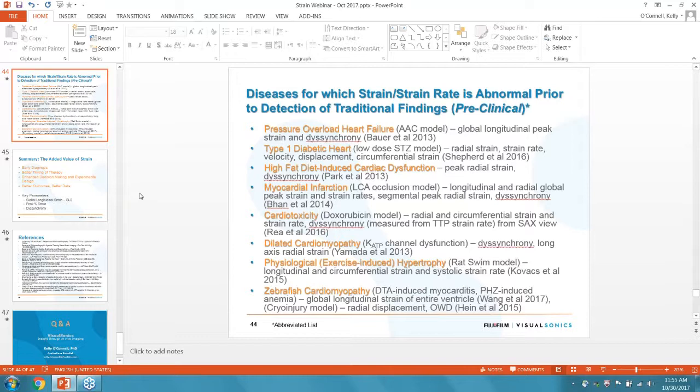validating strain values has all been based on the contractile function, just like ejection fraction is a measure of systolic function, not diastolic function. So you could get the parameters for that, but the values of what those numbers are, they really haven't been explored. So I wouldn't be able to say what's normal, what's not normal. It could be a great project for someone to look at trying to validate those values based on something like your E and A.